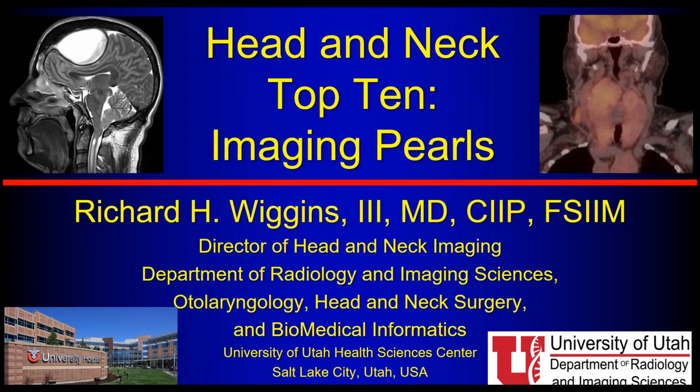I think from a South African perspective, certainly in the public sector, it is very important to triage the patient very accurately, because the patients are booked as head and neck cancer, so it's a standard protocol, and it's very difficult to obtain puffy cheeks and or Valsalva maneuvers.